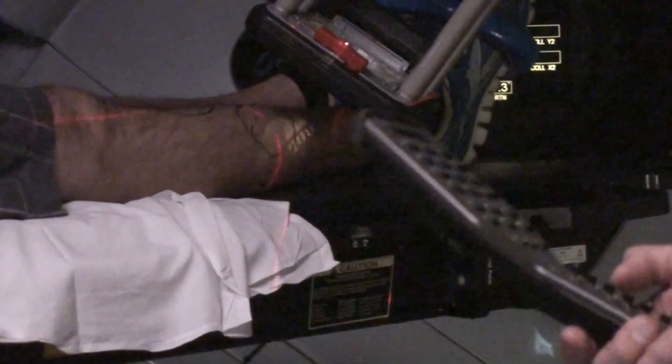So we're going to go back away from it just to demonstrate. If you make a very large move laterally, you can see how the projected field moves that direction. So in order to account for that, you have to move that direction. And since we moved laterally, our projected field is down — it's projecting down — so we have to also go vertically to account for that.